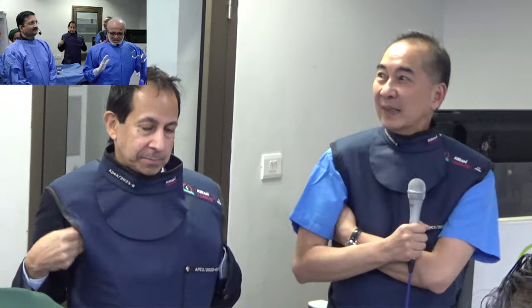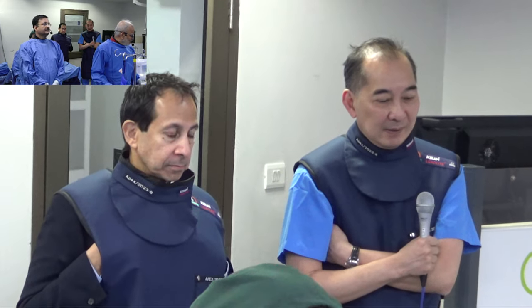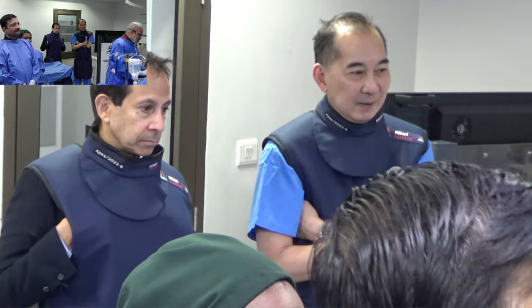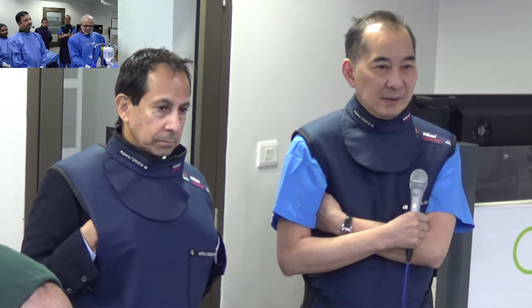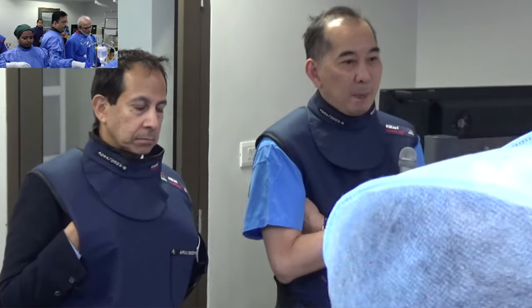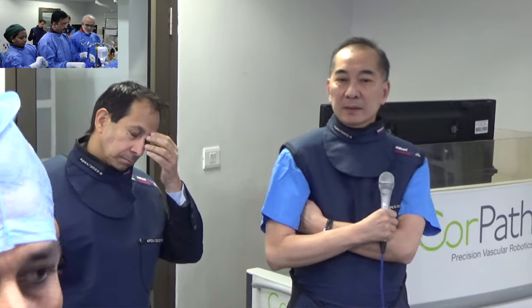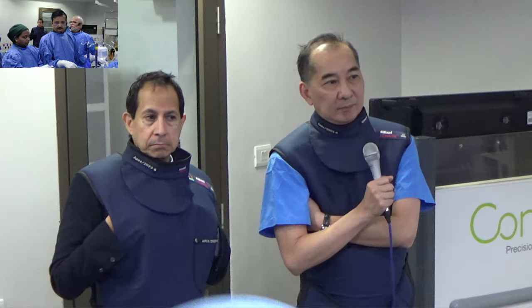So, are you guys able to hear me over there? Yeah, Tejas, we can hear you very well. Yes. It's been a really good discussion so far. This is uncommon, and I've engaged many coronary arteries with dextrocardia, but rarely had to do PCI. So that's often a distinction here. I think you've shown with the Tiger catheter that you've engaged really well, and I would agree with the previous comments and suggestions. Probably just go in with your standard guide catheter and go from there. As a backup, if for some reason the anatomy is more complicated than it appears, and I think sometimes we overestimate the difficulty of doing these, then maybe an Amplatz if you really need it. But I suspect an EBU guide is going to work just fine.